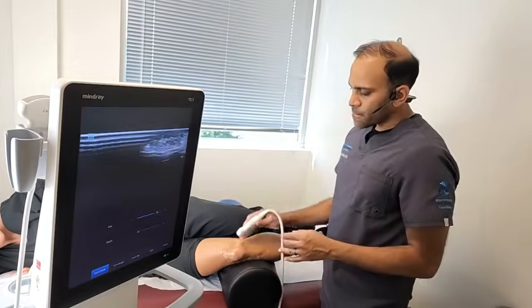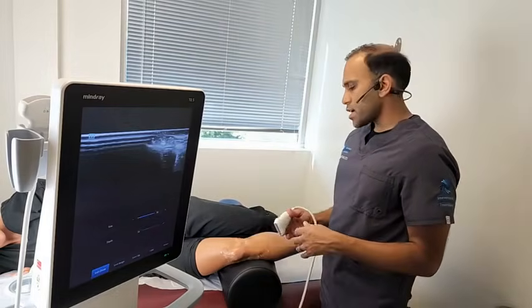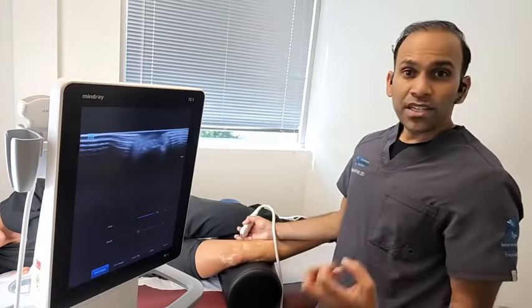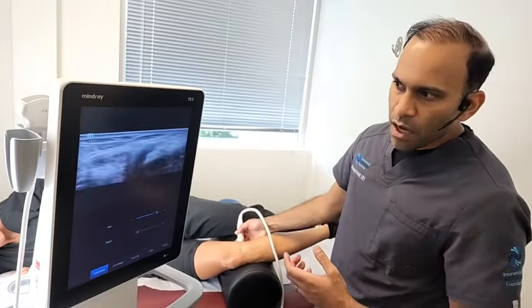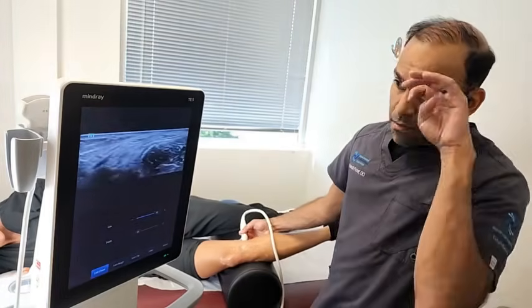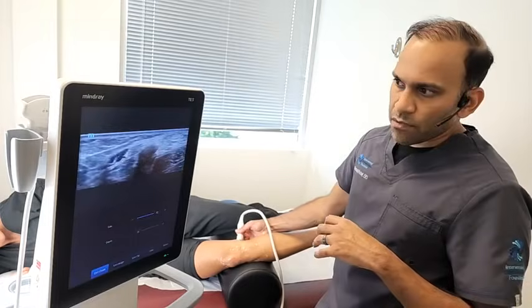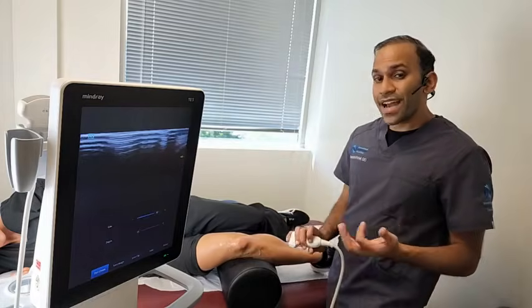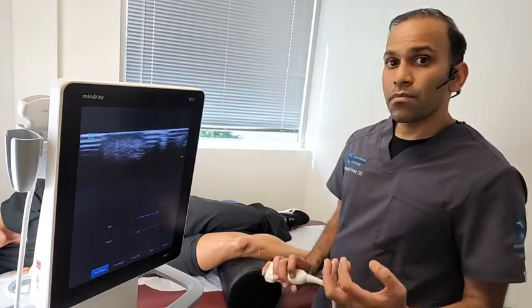Let's see. We can look at some other structures. There's stuff on the back of the knee that we can look at, such as a Baker cyst, where a pocket of inflammation takes place, but I don't anticipate seeing a Baker cyst on you, so it really wouldn't be worth it for us to scan here. But there is something we can actually see: a piece of the ACL, or part of the deeper ligaments.